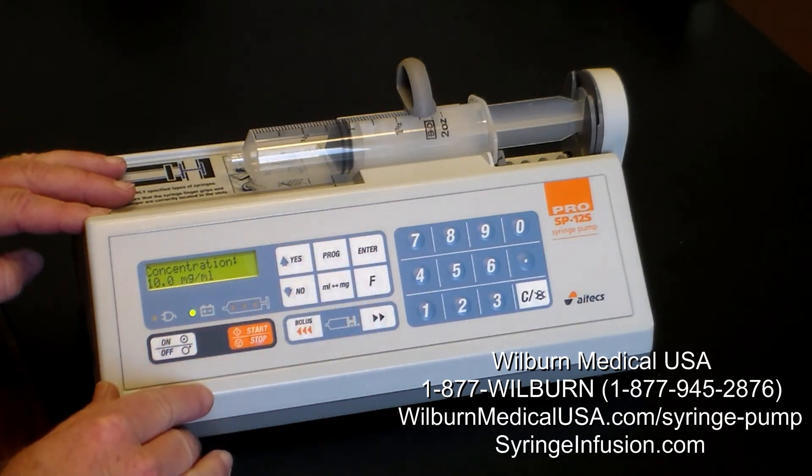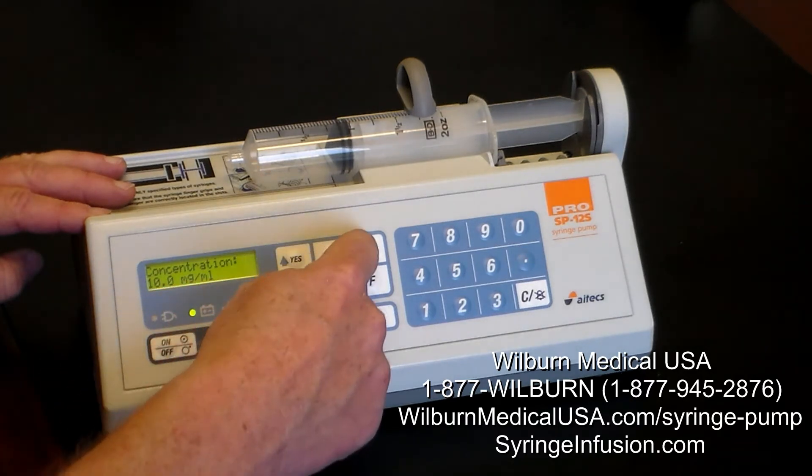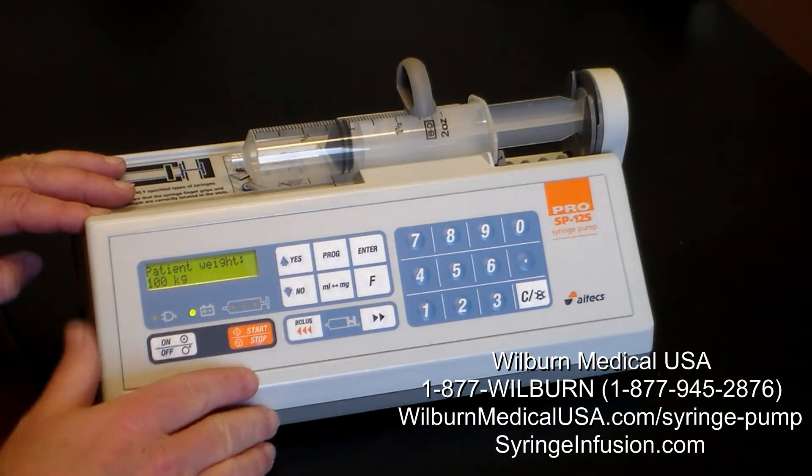If we're dealing with propofol, the concentration will always be 10 mg per mL, so we press enter. For patient weight, 100 kg might be a good example for our demonstration, so we'll just press enter.